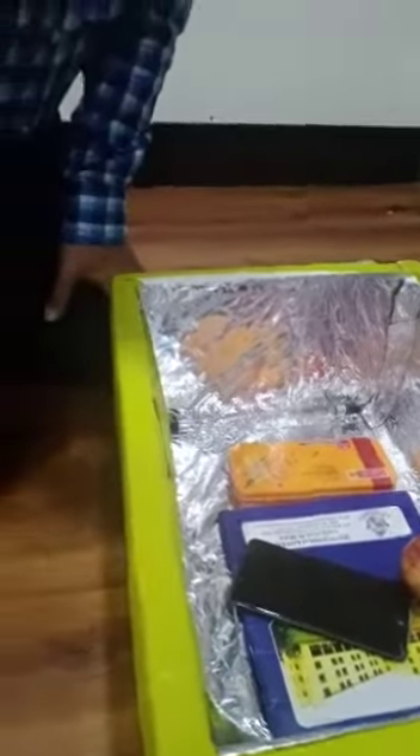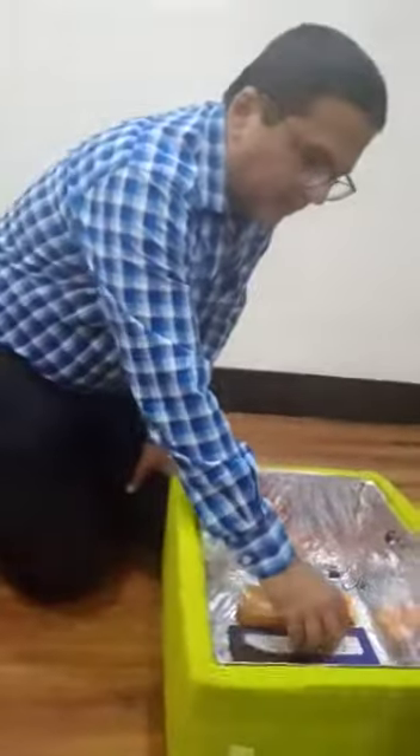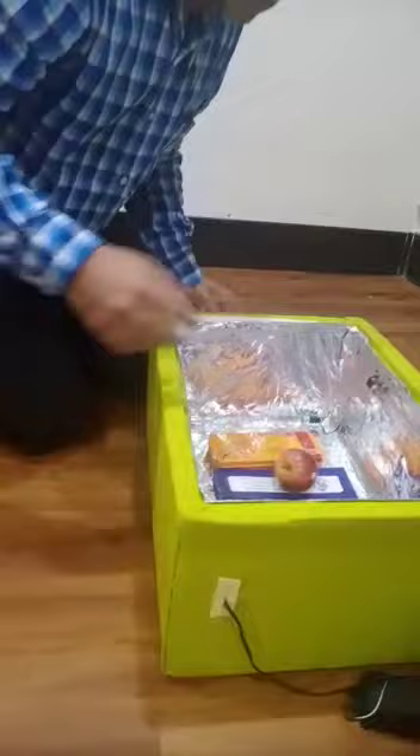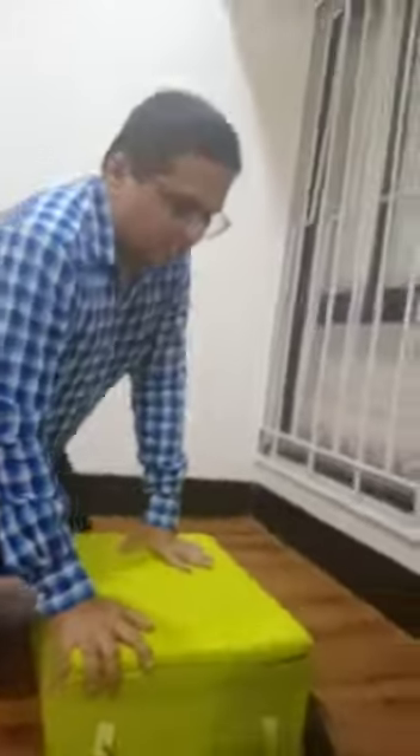You can put anything in this. You can put vegetables, an apple, your mobile, compass, or anything. You just have to close it for five minutes and start the UV rays. You should not come into contact with the UV rays.